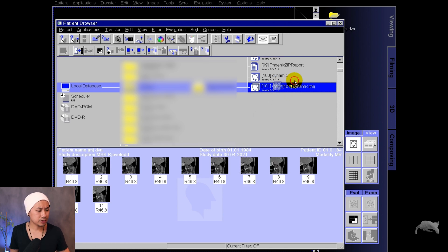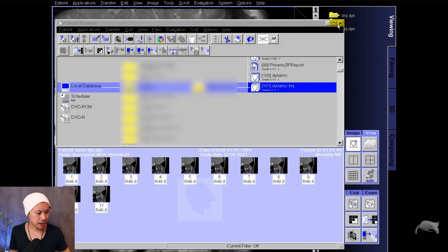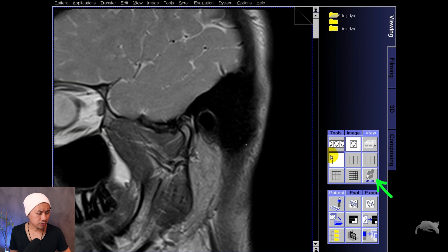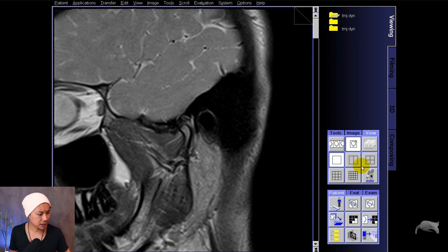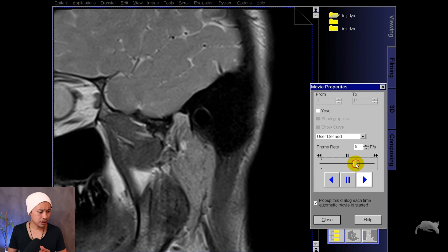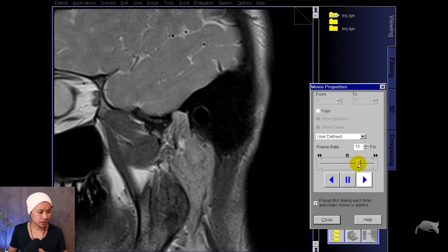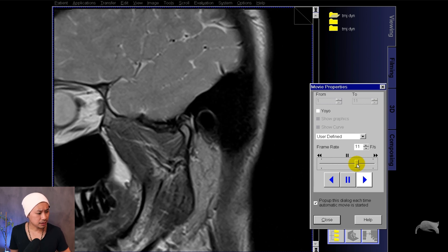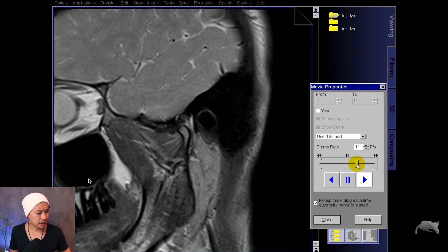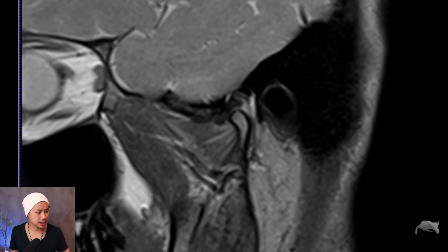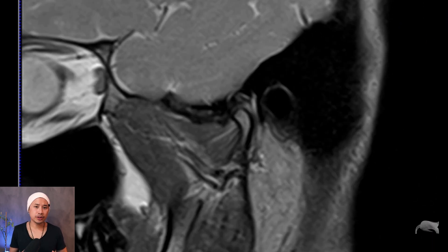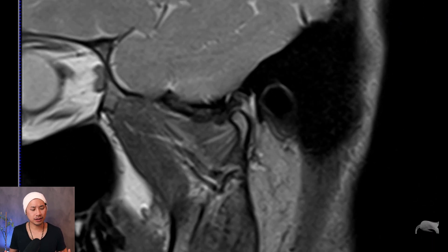Drag and drop it into viewing to check it. Down in the corner here you have this camera kind of thing — just push this button and it automatically plays as a video. Whenever you've done that, you have the option to make it faster or slower. That's it — that's the TMJ right there, with the meniscus. This is one way you can do it. Of course there are many other ways, but it's still pretty cool.